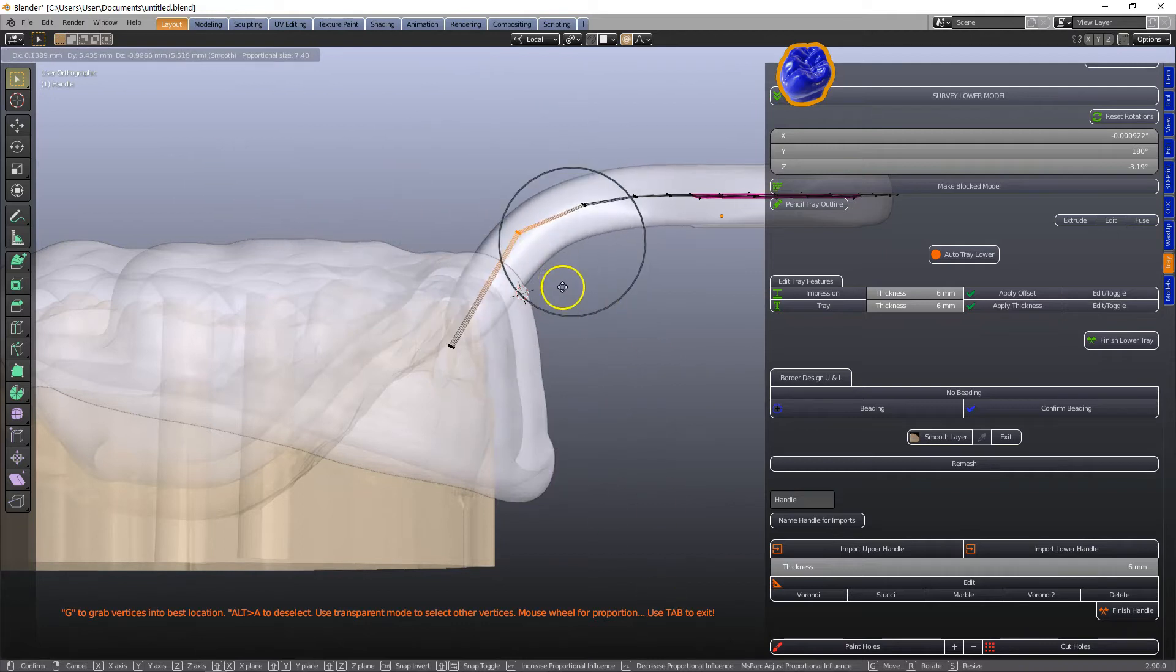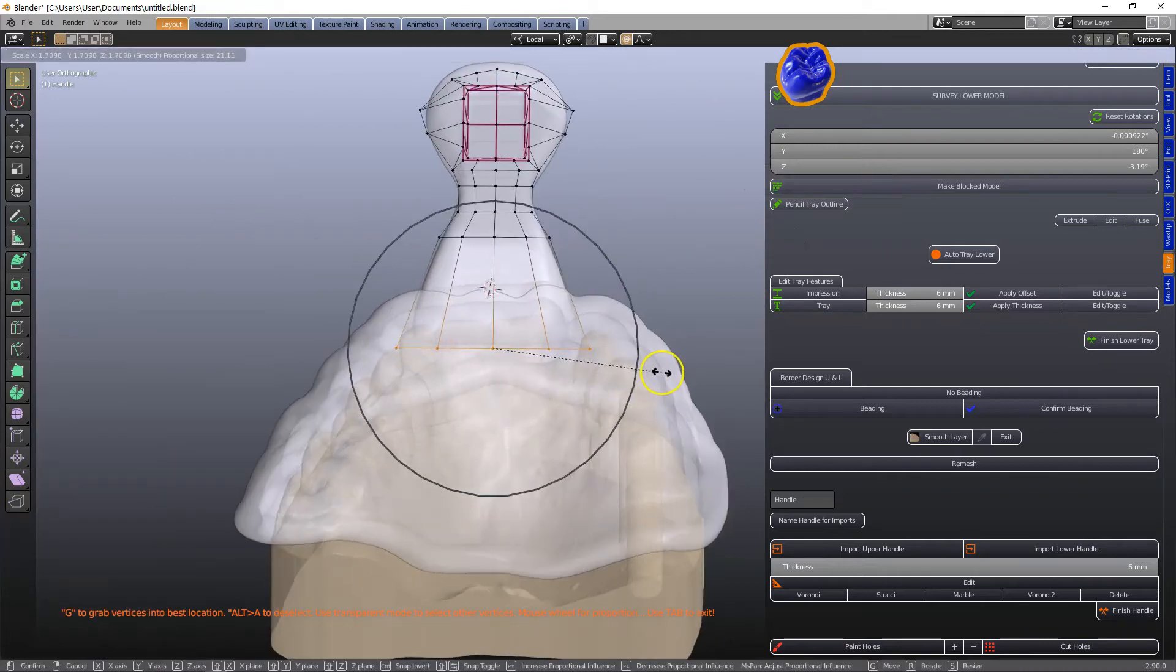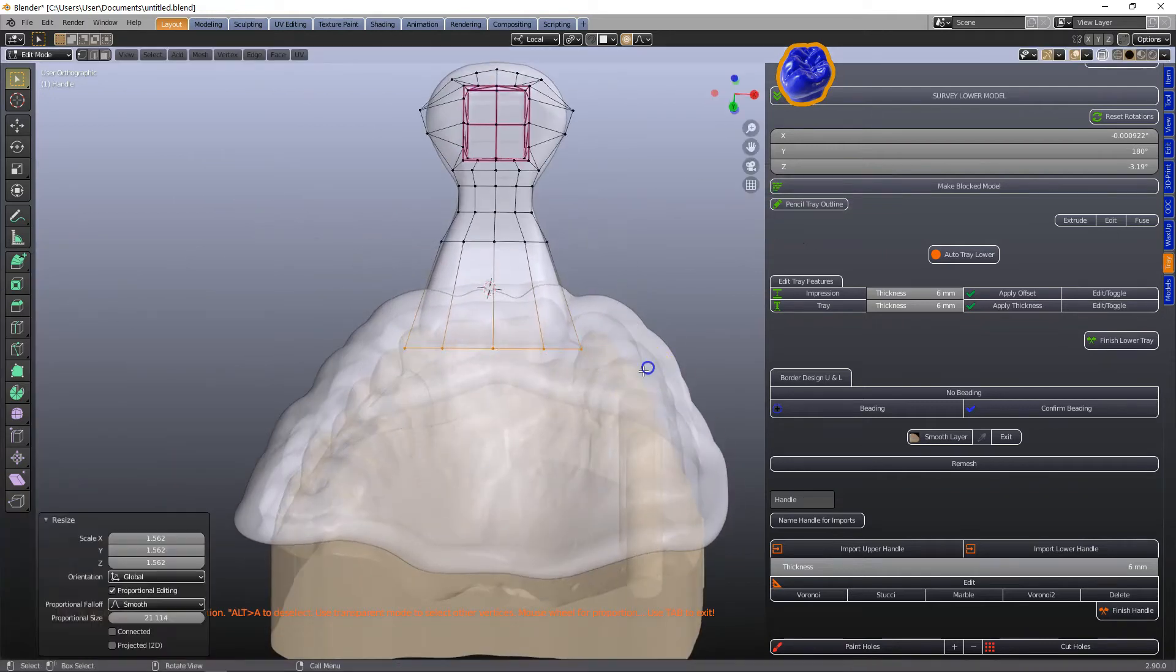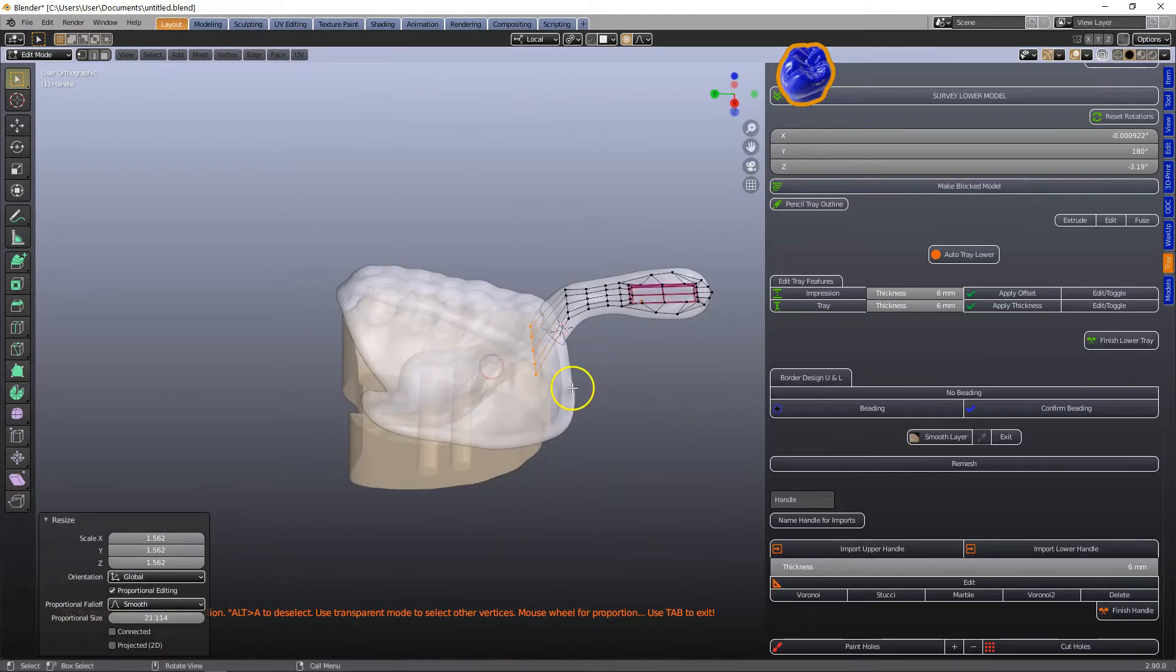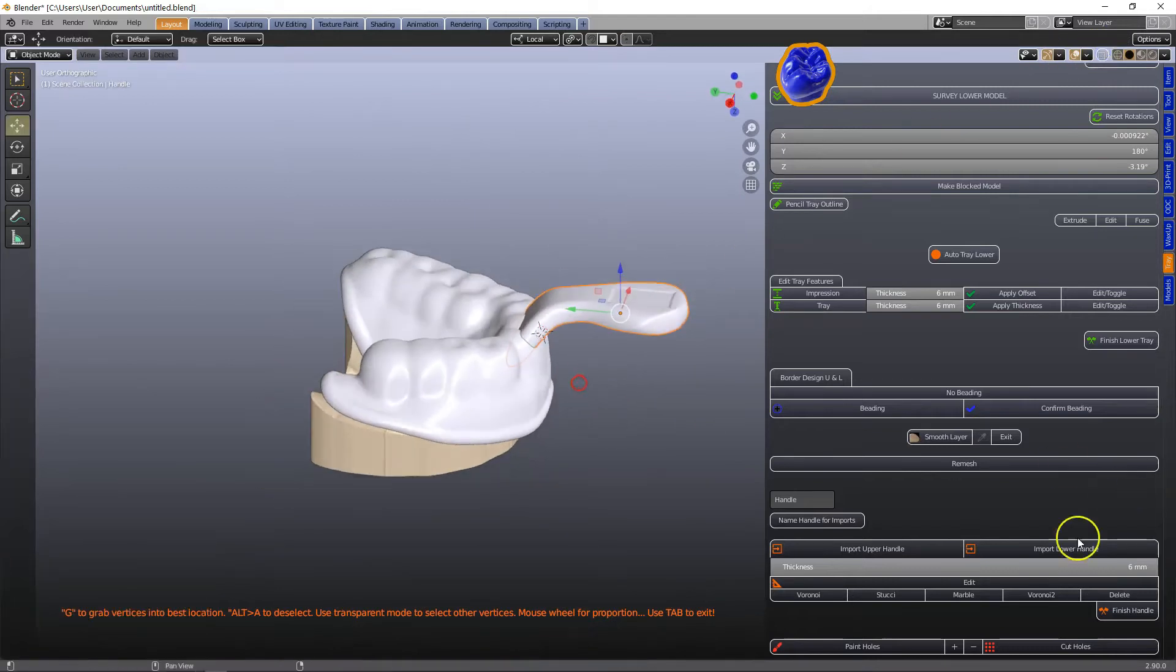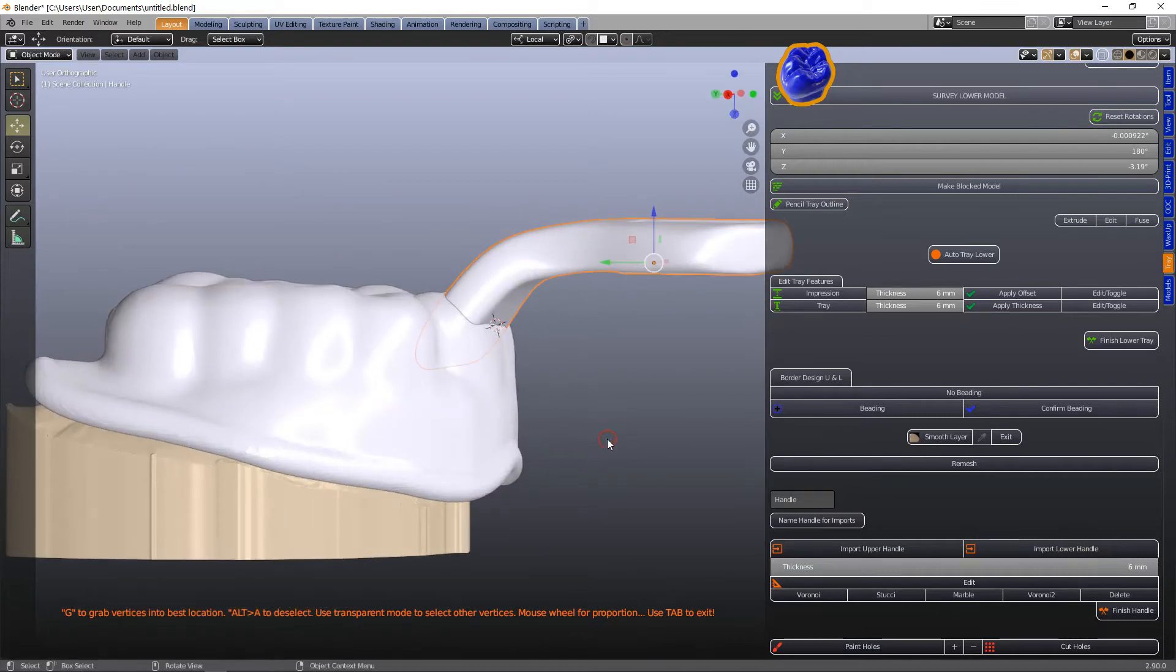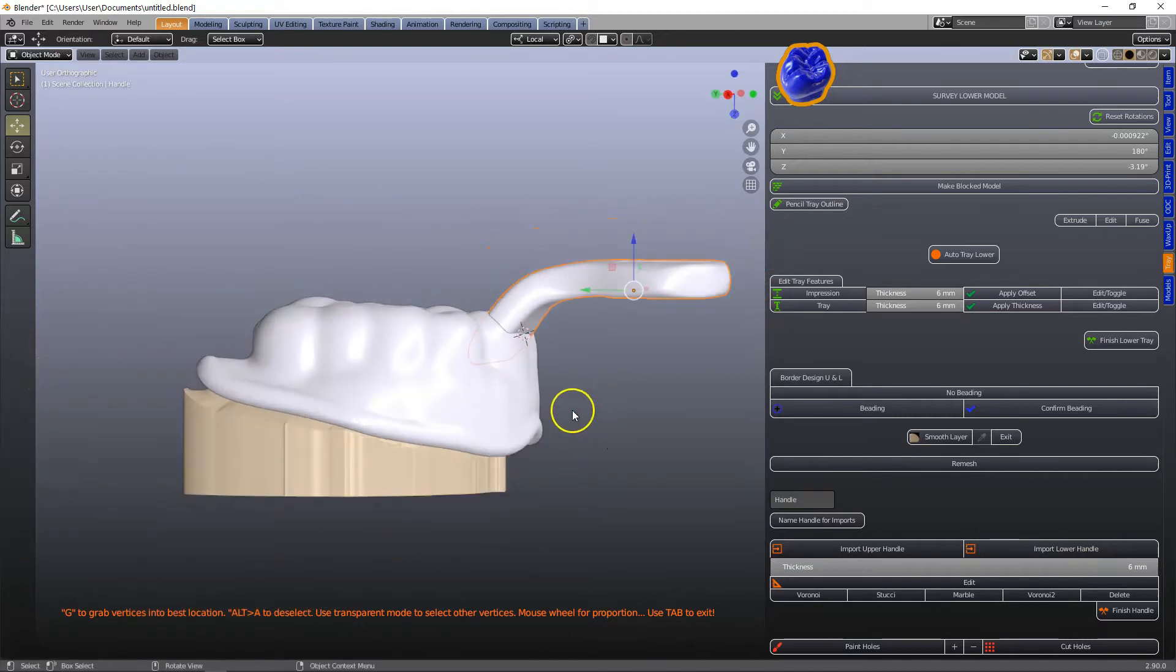It's a bit like chewing gum so we can just move it. S to scale it. So we've got lots of control with this handle. We can make it thicker if we like. It's 6mm default.